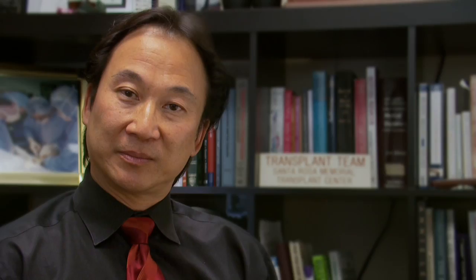You will see the patient afterwards walk out of our office completely coherent, awake, and happy with her results. What areas are we going to take care of for you today, Candice?